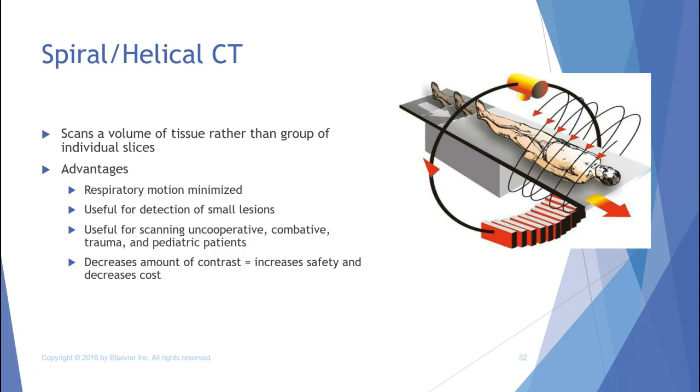It also decreases the amount of contrast, which increases safety and decreases cost. Now, decreases the amount of contrast, we're going to have to talk more about that at a different time.